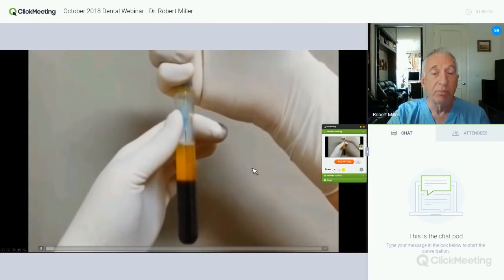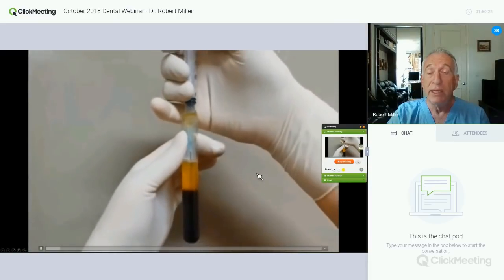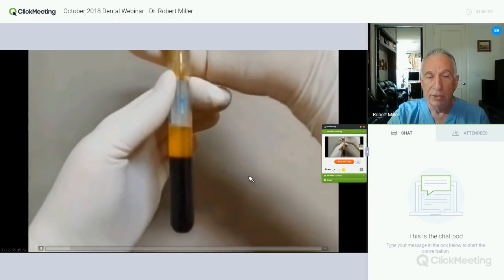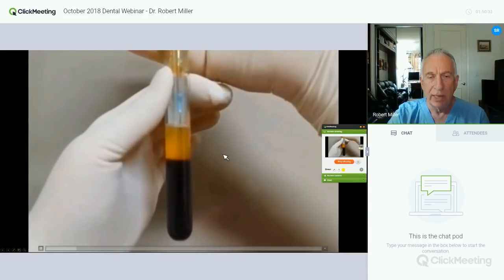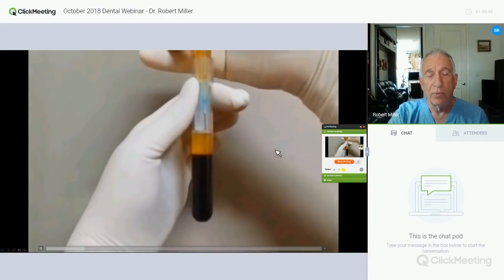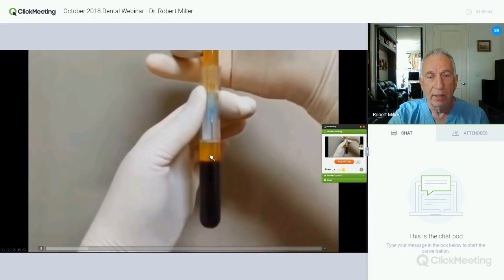beta-tricalcium phosphate. So if you're going to use plasma, we'll spin down our blood tubes. We'll harvest only the yellow portion in this. Here we are just using a sterile irrigating syringe to take off the plasma. These are in white tubes that are only spun for 3 minutes. We don't want it to coagulate. We want it in liquid form. And we'll draw that off.